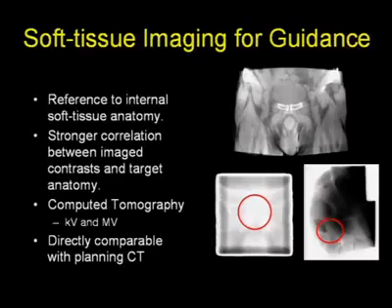Since the images are similar, they're equally easy to interpret. And again, this is CT quality, so the radiation oncologist can probably use these images offline and recontour them if need be, and initiate some adaptive strategies this way.